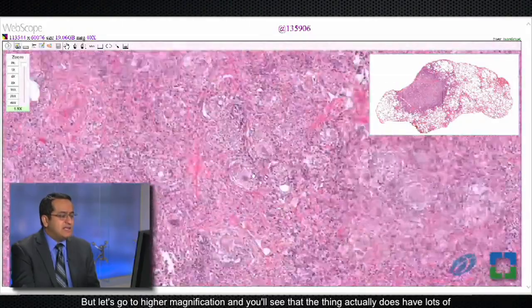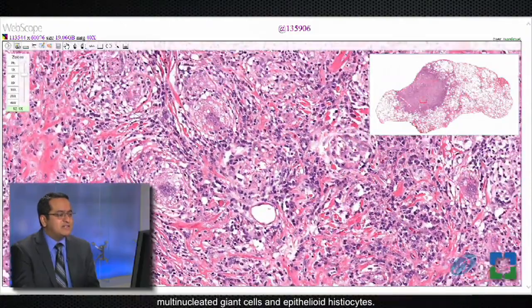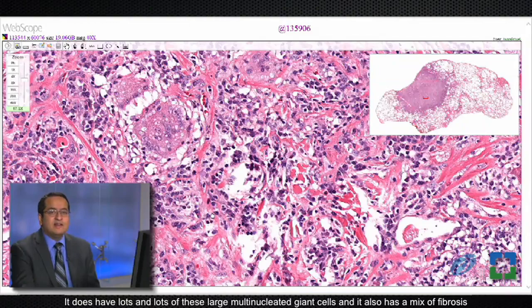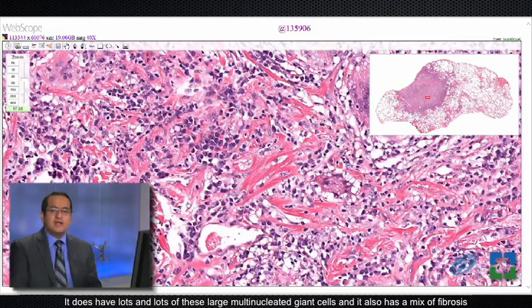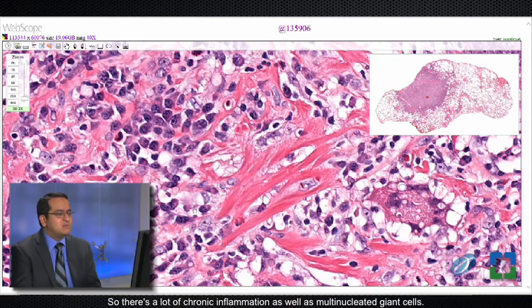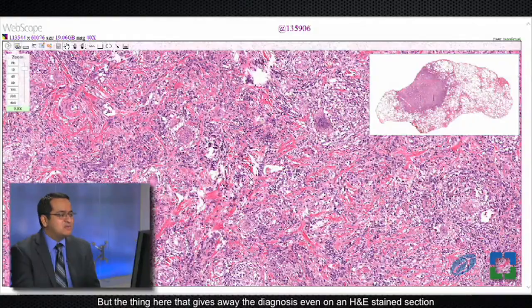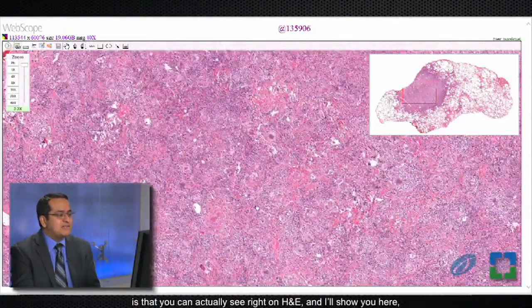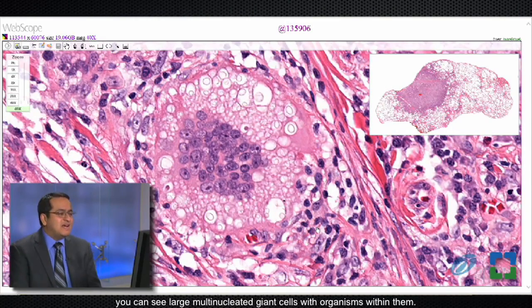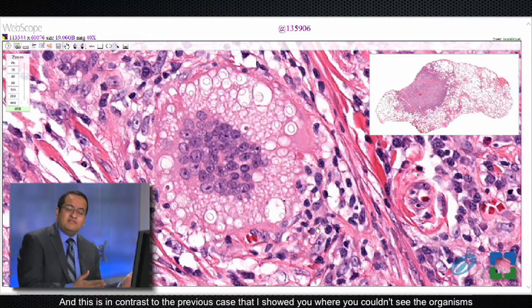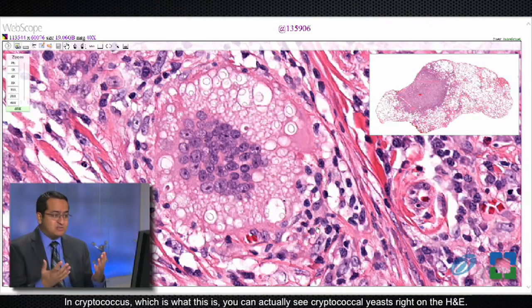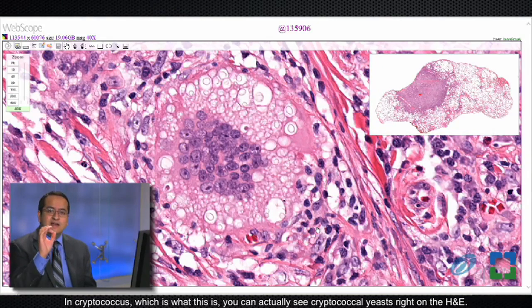At higher magnification you'll see that the lesion actually has lots of multi-nucleated giant cells and epithelioid histiocytes — especially multi-nucleated giant cells. So this lesion is granulomatous, with lots and lots of these large multi-nucleated giant cells. It also has a mix of fibrosis and chronic inflammation including lots of plasma cells. The thing that gives away the diagnosis even on an H&E stained section is that you can actually see — right on H&E — large multi-nucleated giant cells with organisms within them.